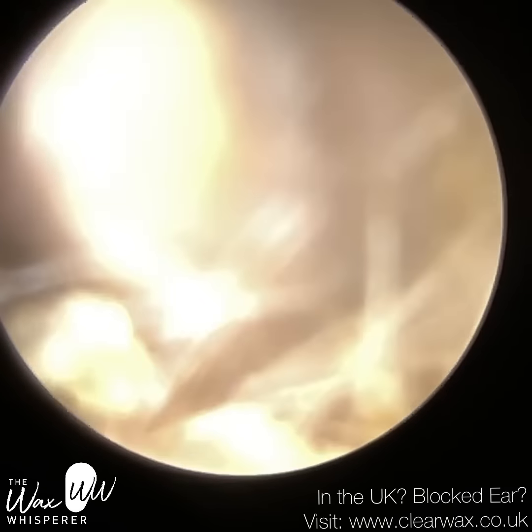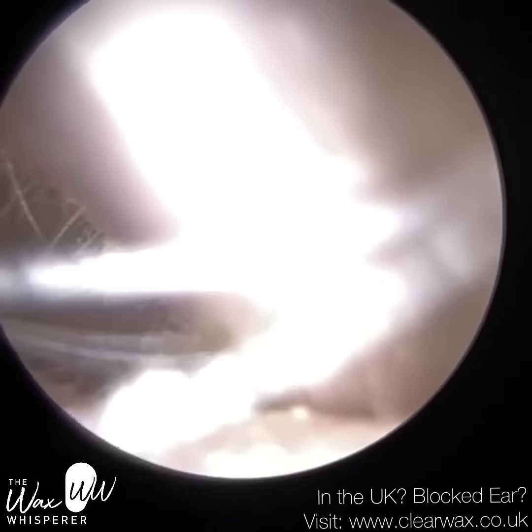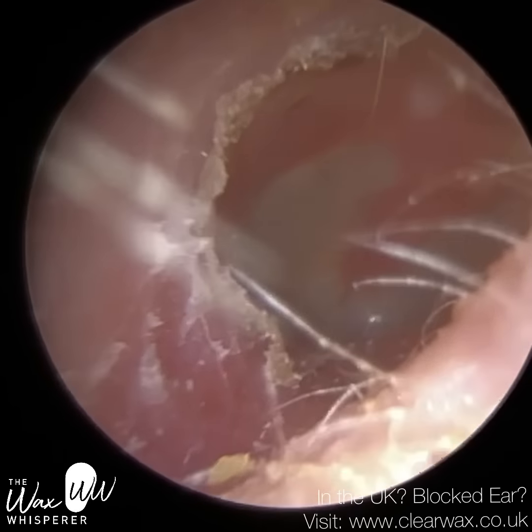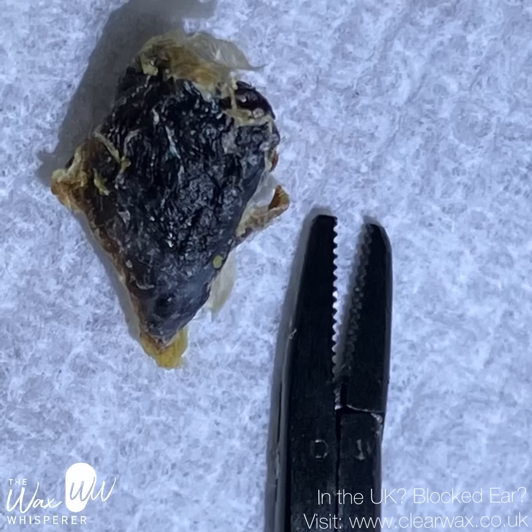Again, I'm just going to stretch the ear open at the valley of the entrance there, and it's quite a steep valley because of how narrow the patient's ear canal was. So you can see a bit of keratin there. We're going to leave that. It's not going to cause the patient any problems whatsoever.